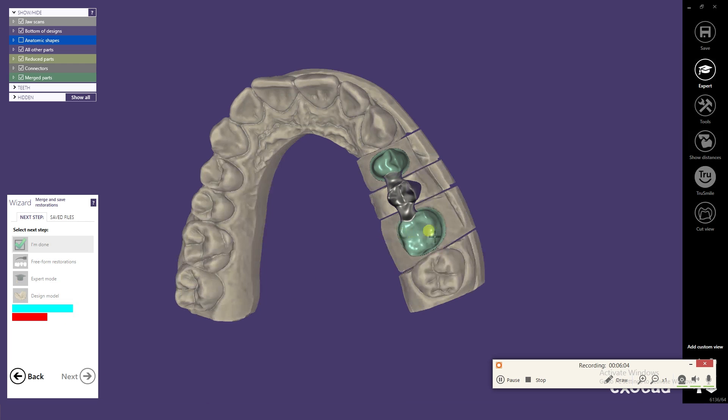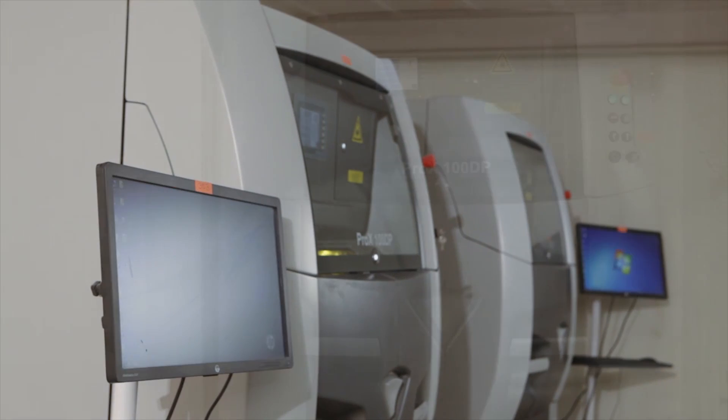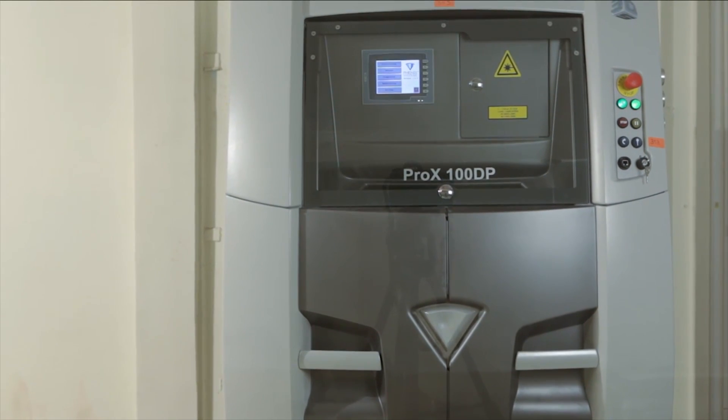This design is then sent to the DMLS unit where the sintering happens. This is what the DMLS machine looks like and this is how the procedure happens.